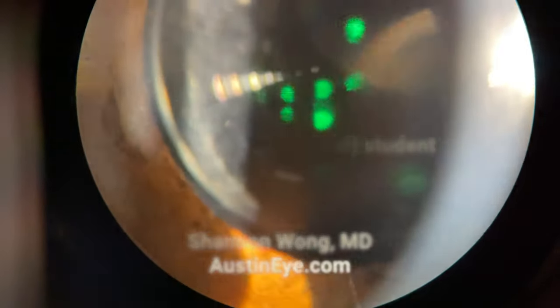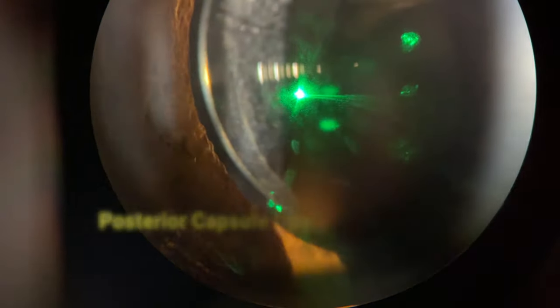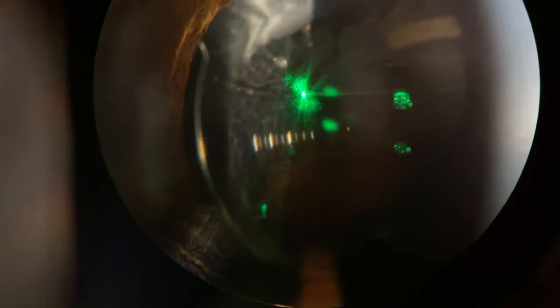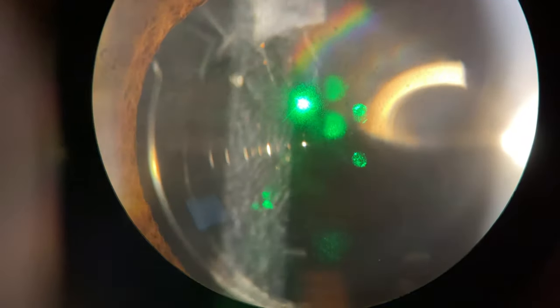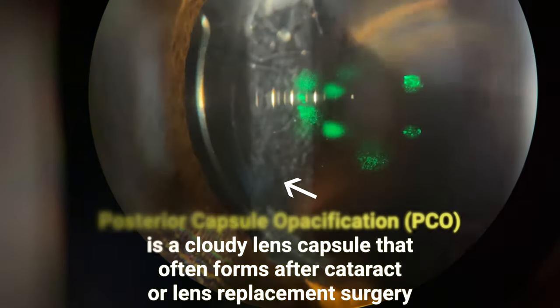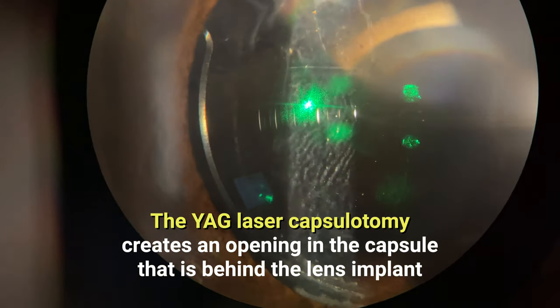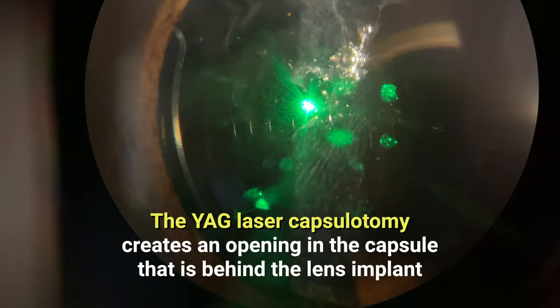Keep looking toward the green light — you can blink at any time. I'm going to get these two lights to merge into one, and that focuses my laser exactly where I want it. The laser beams deliver energy to one spot.